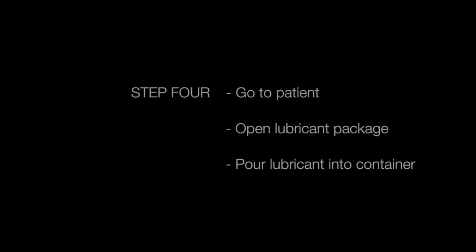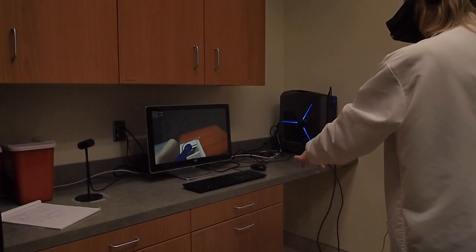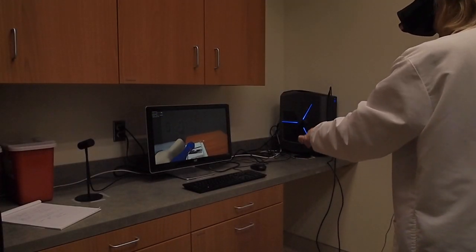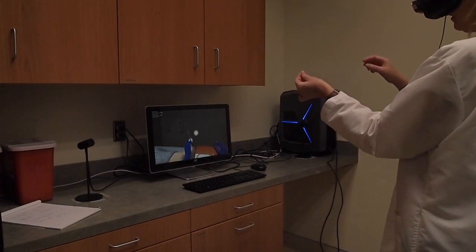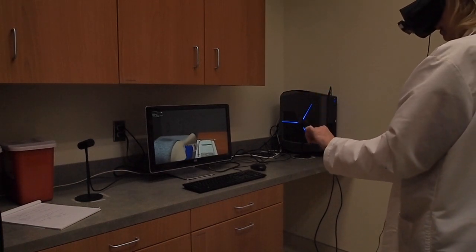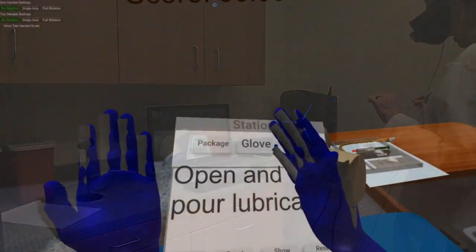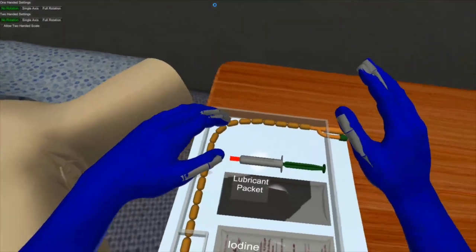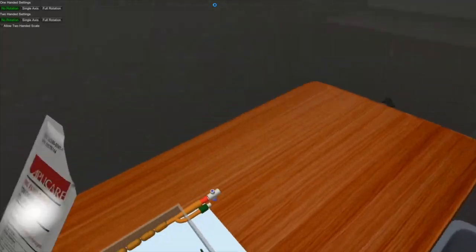Now press the operation button and we will prepare lubricant. Pick up the lubrication package and hold it so that a second white light appears, then rip it open. Pull the lubricant tab and pour it into the reservoir.